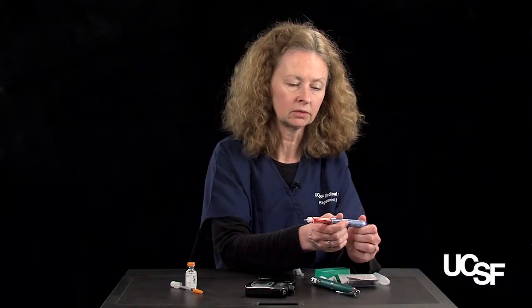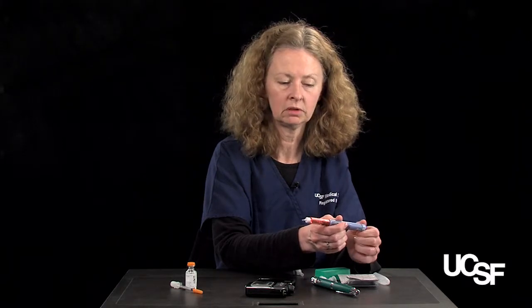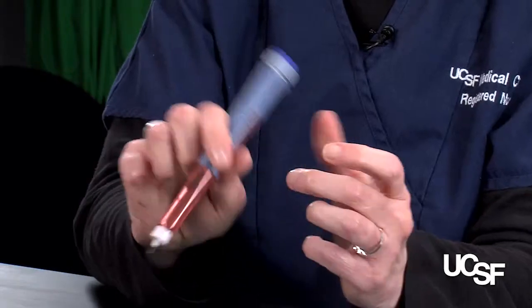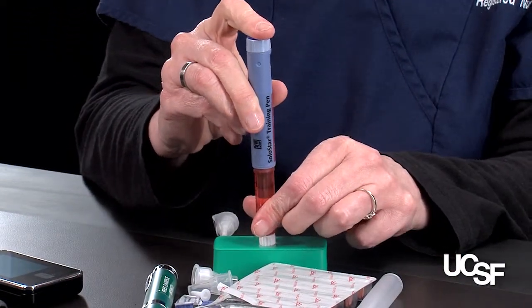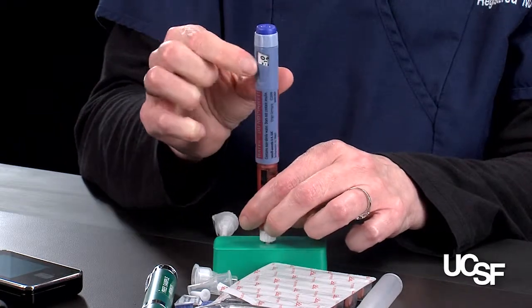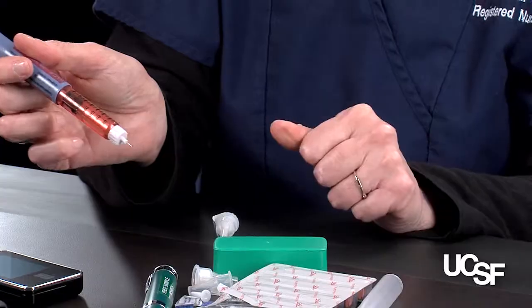Then I can dial my dose. So that's 1, 2, 3, 4 units. Same thing, 90 degrees. Push the insulin in. That brings us back to 0. We count to 10, and we pull the needle out.